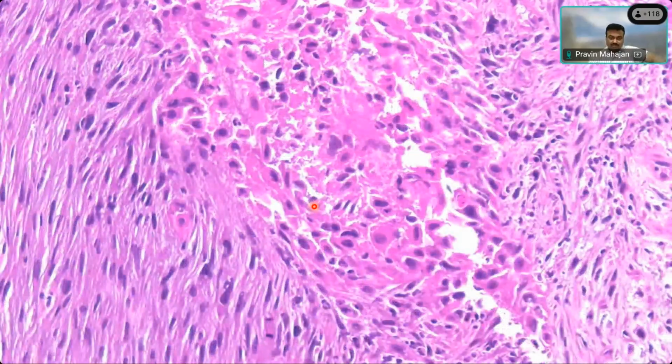What are these cells? Somebody says polygonal cells. Very good. So she has picked up that polygonal cell. What kind of polygonal cells? She is saying squamous. Yeah, she's absolutely right. So these look like squamous cells, right?